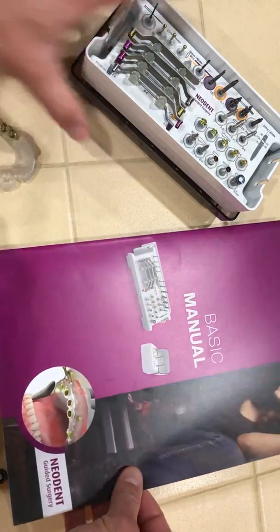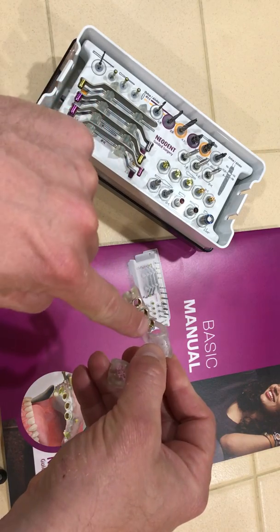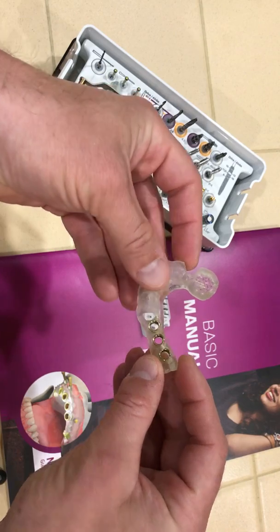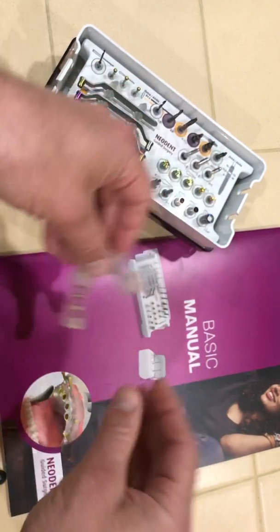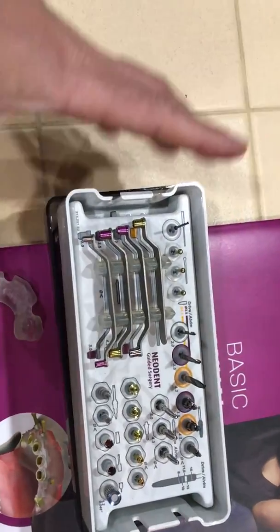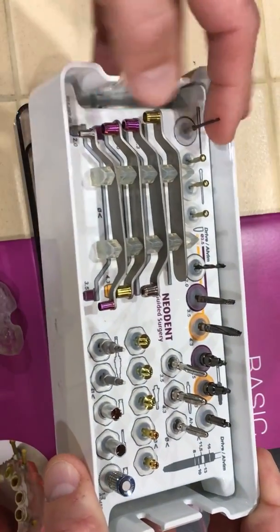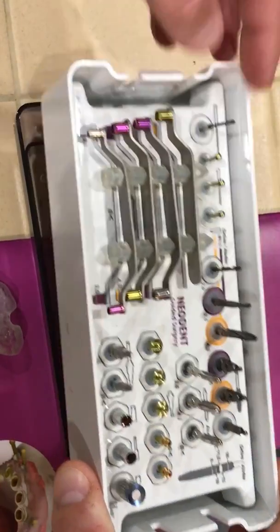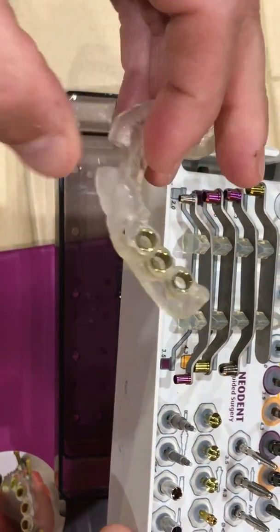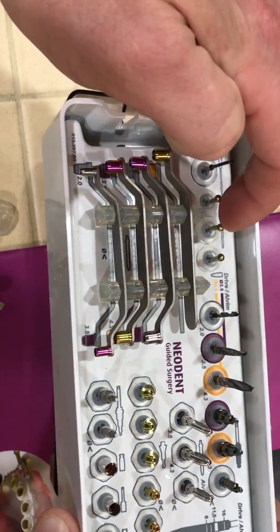Sometimes they ask some very interesting questions about things like the sleeves and sizes. This particular guide has regular sleeves that are yellow. Up in the upper left here is our fixation drill for the facial aspect of the guide. This one doesn't need it to help fix or lock the guide into position. It's a 1.3 drill, and then it has the pins — 1, 2, 3.